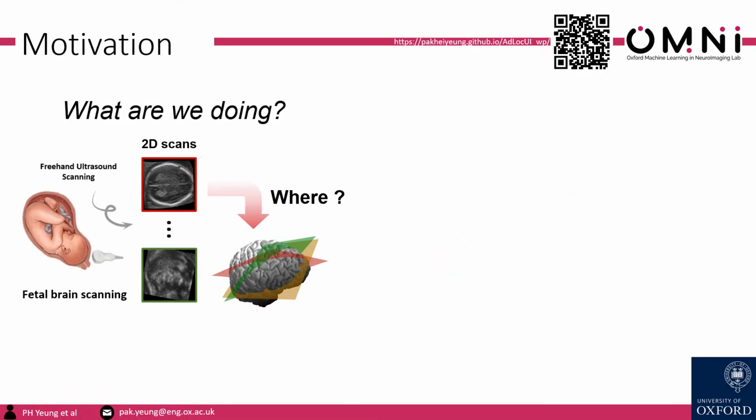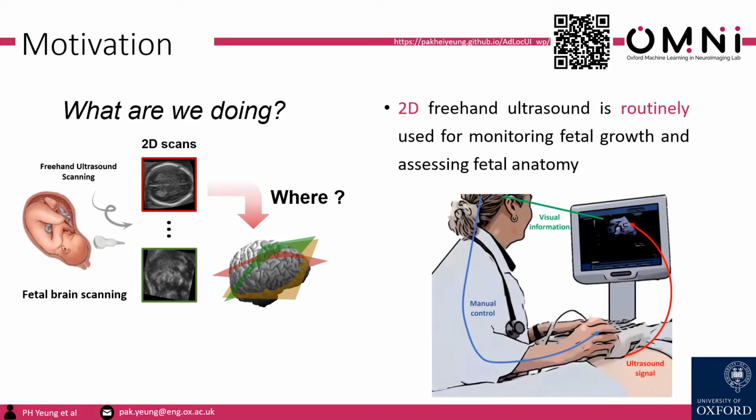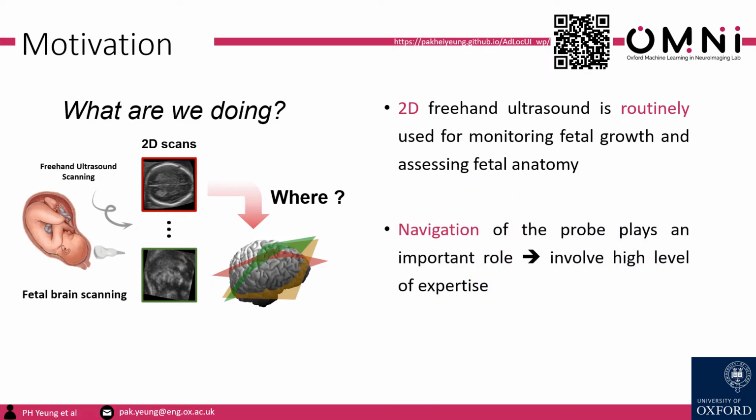This application is clinically important in the sense that 2D freehand ultrasound is routinely used for monitoring fetal growth, where navigation of the probe plays an important role in the scanning. This work tries to assist this task with a computer-aided solution.